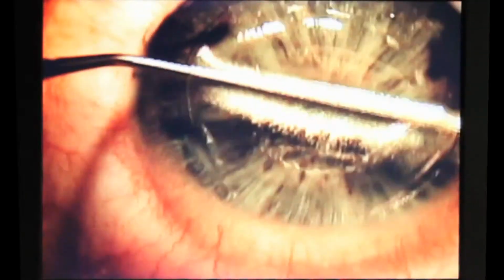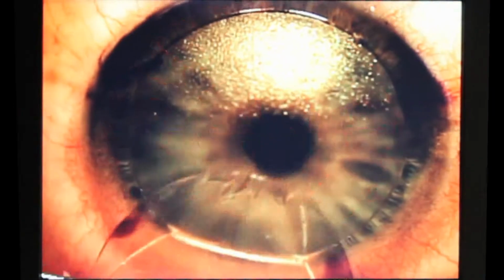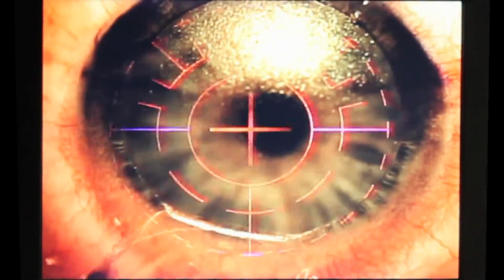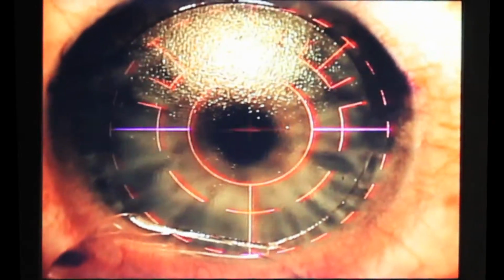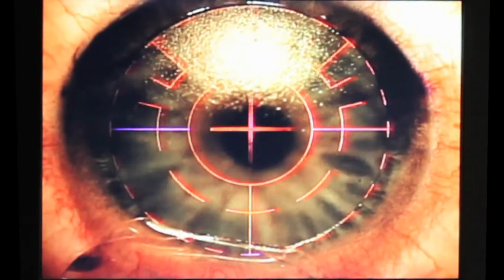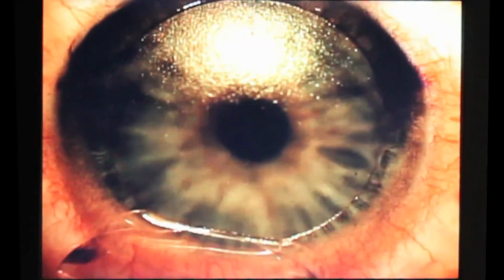It looks like he's playing tug of war with my eye. I wonder what happens when they rip the flap off on accident, if that ever happens. I guess this is one reason you definitely want a guy with a lot of experience. So he acquires the target. He locks on. I feel like we're in a Star Wars TIE Fighter. Then he starts vaporizing flesh.